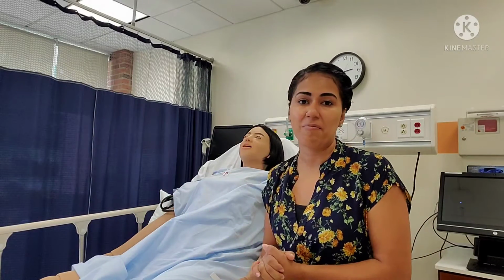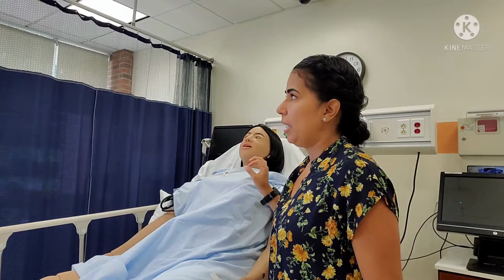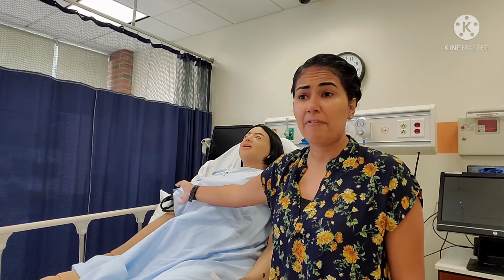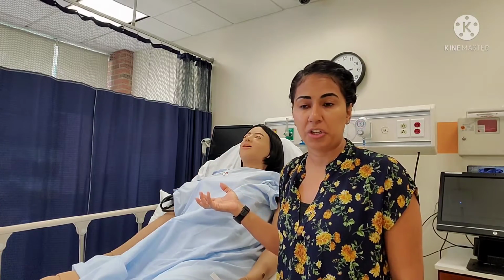The right side's not going to have breath sounds or very diminished compared to the left. Sometimes there's a slight change, a small change. So if I just listen to the right, okay, they sound a little diminished. I'm not really impressed. But if I listen to the left and they sound really nice and clear and I have a nice strong breath sound, then that can really let me see the big picture here, okay?